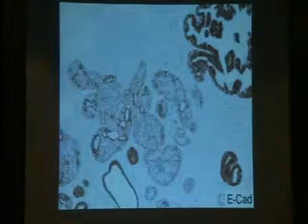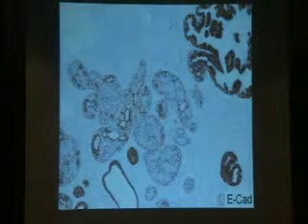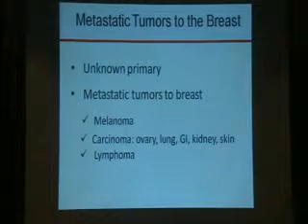So that is probably the most common use of immunohistochemistry I do in my practice. A lot of the lesions can show mixed patterns, but when I see loss of E-cadherin positivity in a uniform epithelial proliferation with appropriate cytology, I would make the diagnosis of lobular lesion.